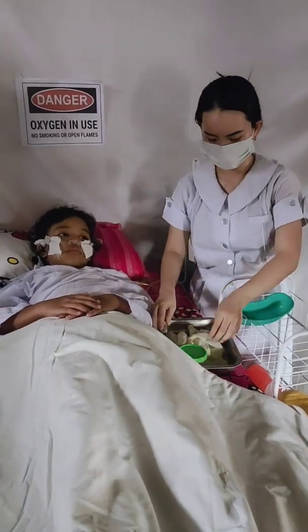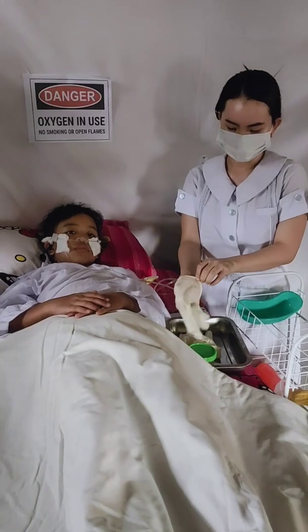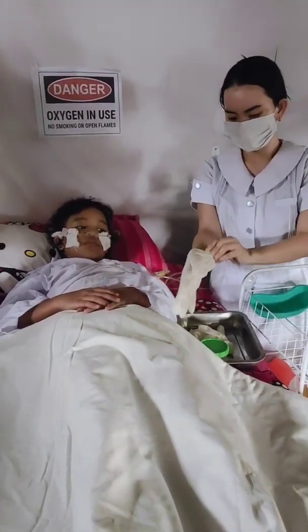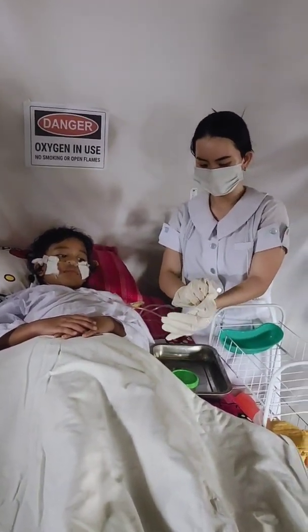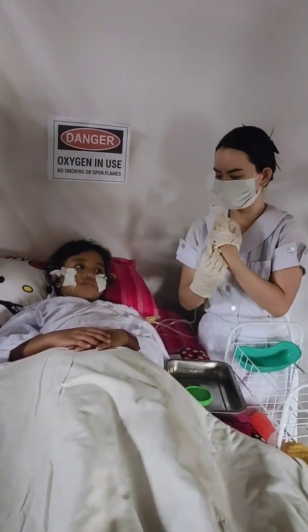Perform hand hygiene and put on gloves. Remove and clean the cannula and assess the nares at least every 8 hours or according to agency recommendations. Check the nares for evidence of irritation or bleeding. The rationale for doing this is to permit early detection of skin breakdown or inadequate flow rate.